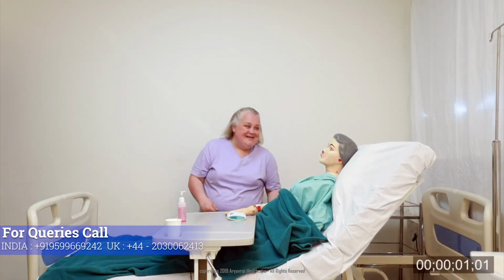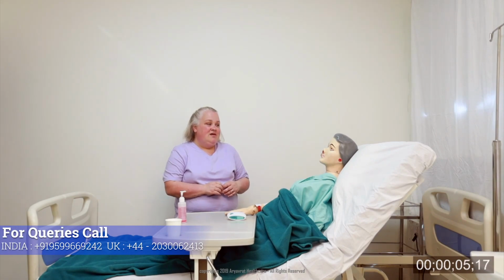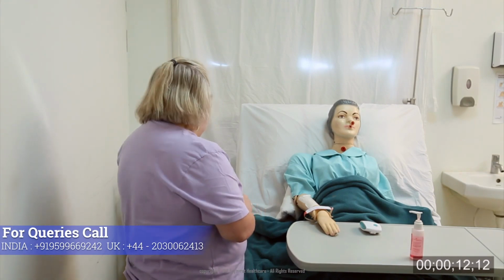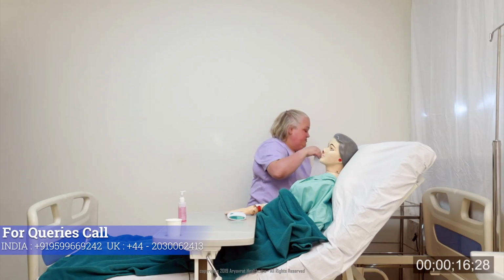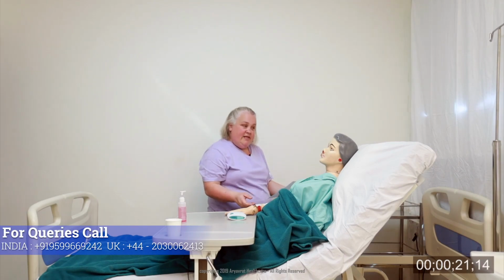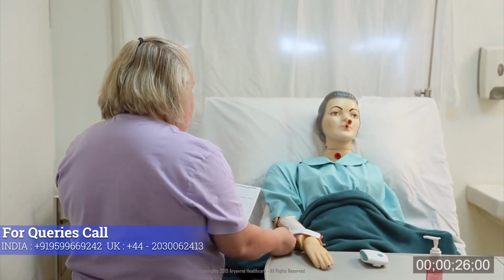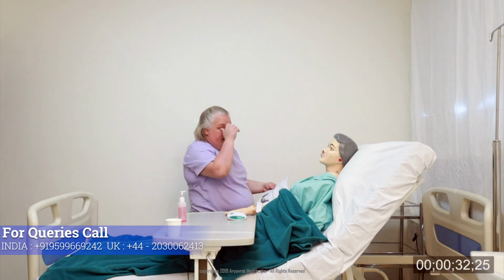Good afternoon. My name's Julie. I'm one of the nurses here looking after you this afternoon. Can I just double check your name, please? It's Helen Gray. And your date of birth? It's 6th of June 1950. Okay. And what would you like to be called? Helen, please. Okay. Helen, can I just double check that with my notes and your wristband? Okay, so Helen Gray, 6th of June 1950, hospital number is F001001HC.